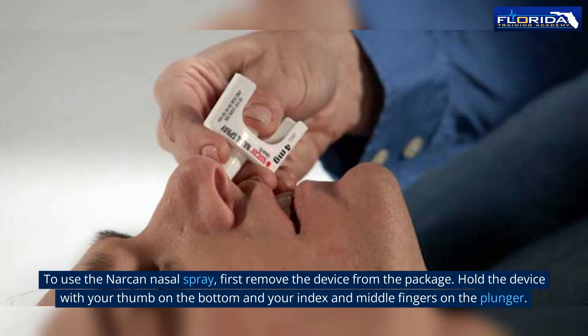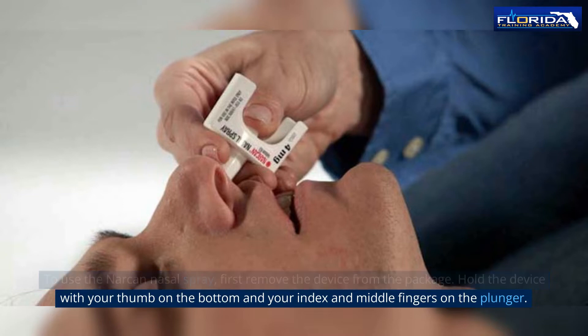To use the Narcan nasal spray, first remove the device from the package. Hold the device with your thumb on the bottom and your index and middle fingers on the plunger.